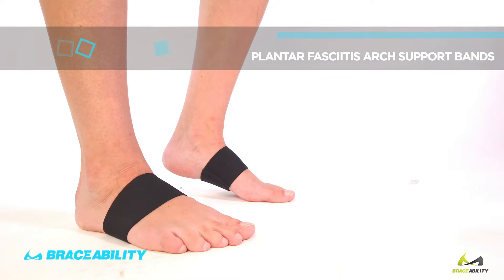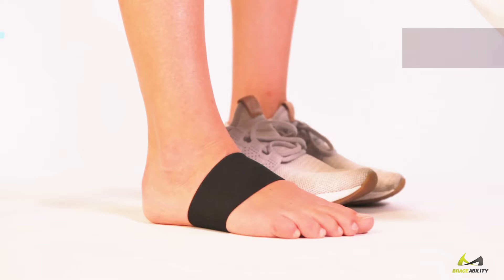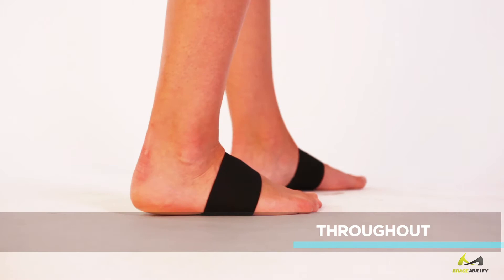Plantar Fasciitis Arch Support Bands by Braceability. Ultra-thin, lightweight, and breathable, keeping you cool and comfortable. Their non-bulky fit allows you to comfortably wear these with shoes, sandals, or socks.